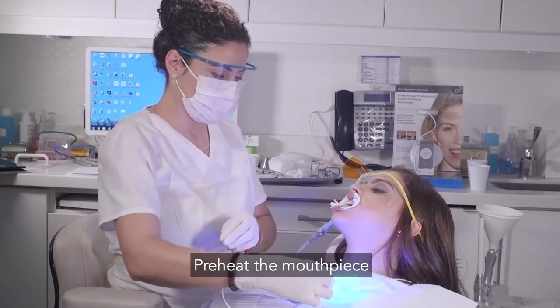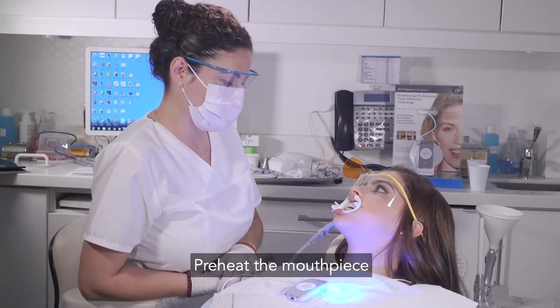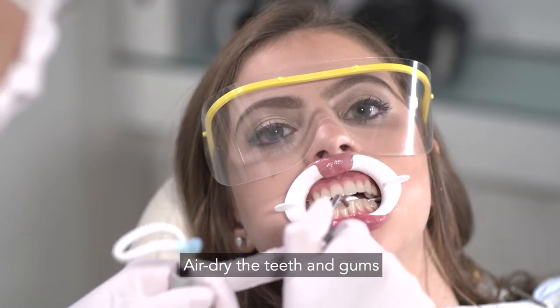This is a great time to turn on the Glow device so the mouthpiece can preheat for 8 minutes and will be at the optimal temperature when the whitening begins. Air dry the teeth and gums.